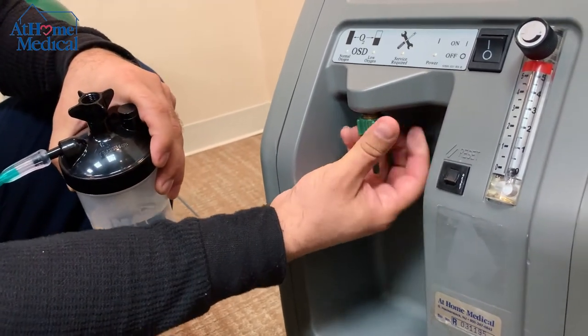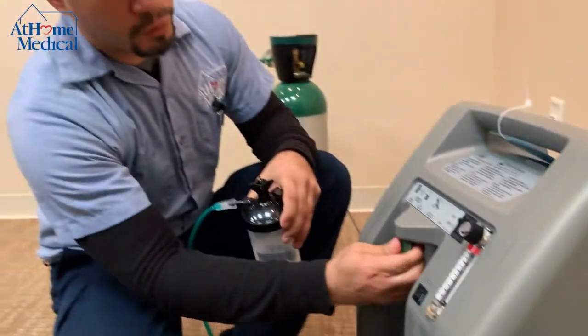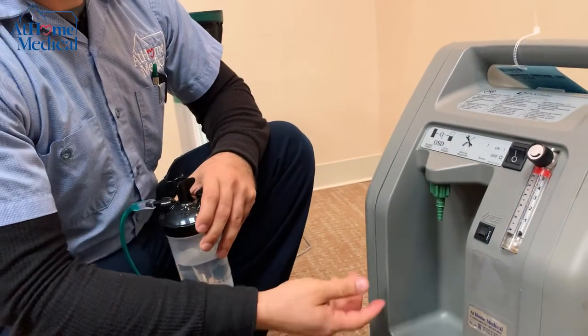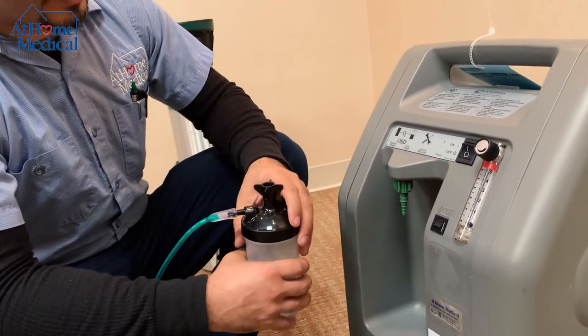If there is no humidifier bottle, you would have this adapter — a lot of people call it a christmas tree adapter. Without a humidifier bottle, if you're not prescribed for one, you would just connect your tubing directly to this christmas tree adapter.